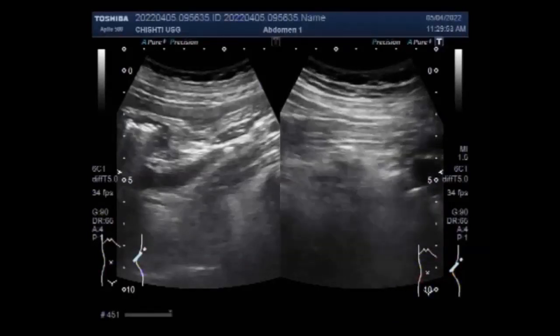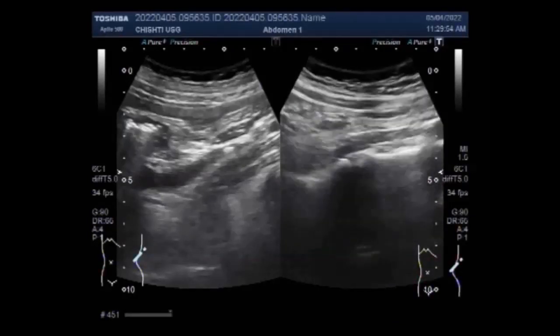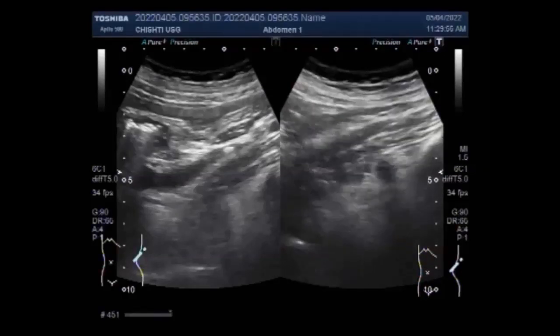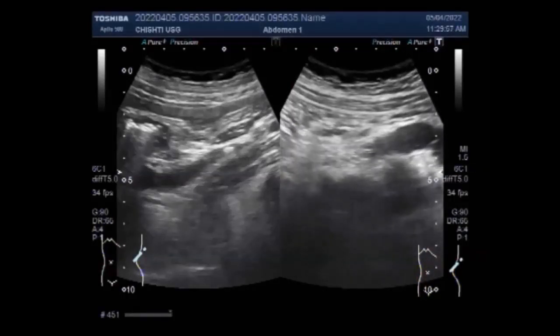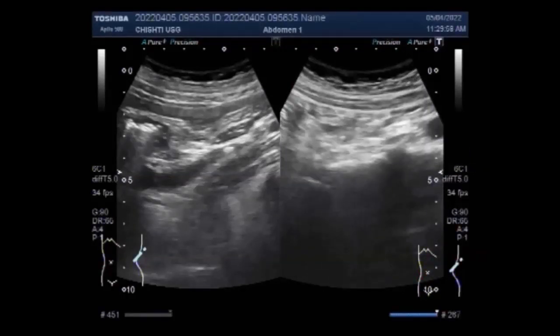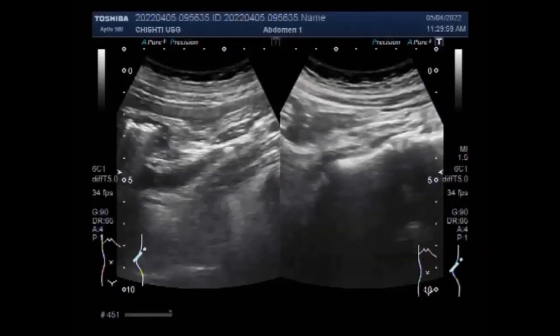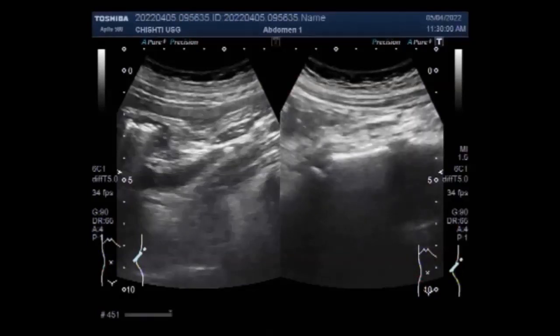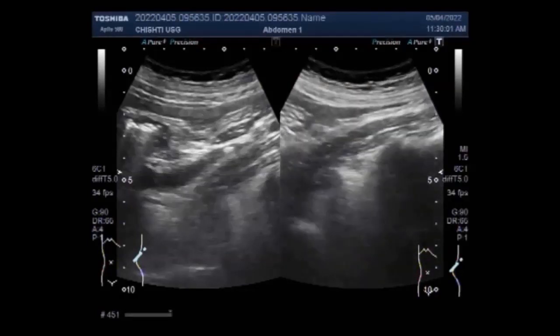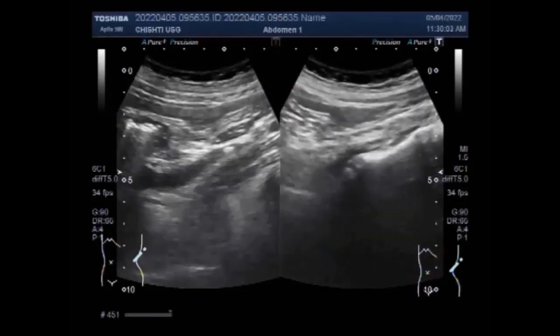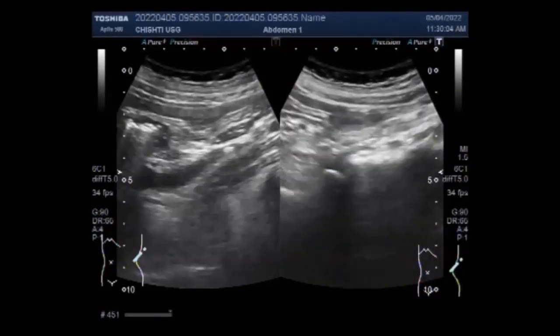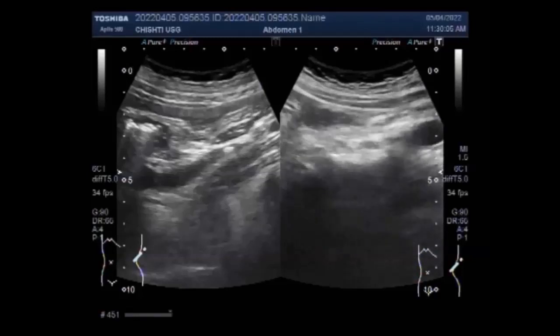Now you can see the scanning of the ureter. The hydro-ureter is very minimal, as the stones are smaller.